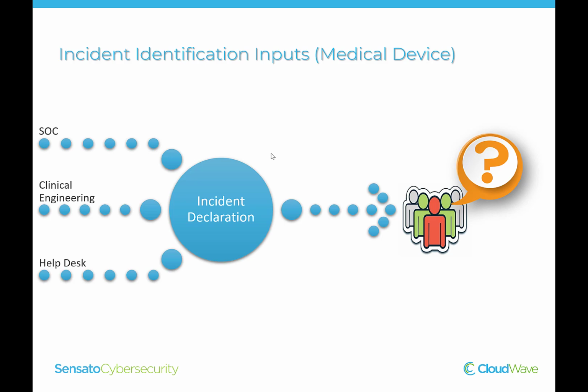Typically, with any incident, we're trying to determine whether we're going to contain or prevent this incident within 14 minutes or less. There's a lot of reason for that number of 14 minutes or less, and I'm happy to discuss it further if you're interested. But ultimately, from the moment these inputs are coming in, these reports are occurring, to the moment we declare an incident and we get people involved, we're talking about 14 minutes.